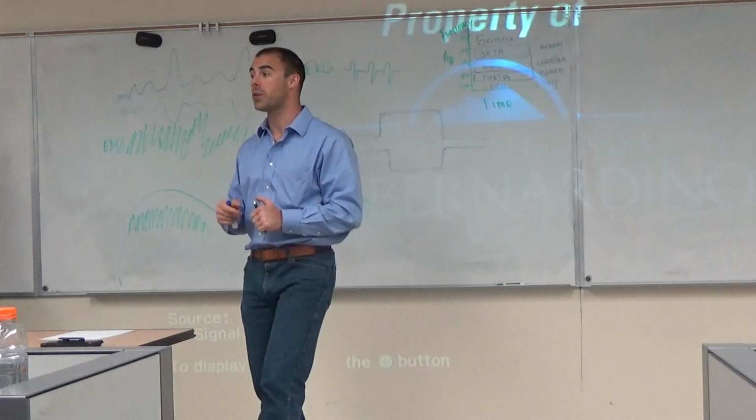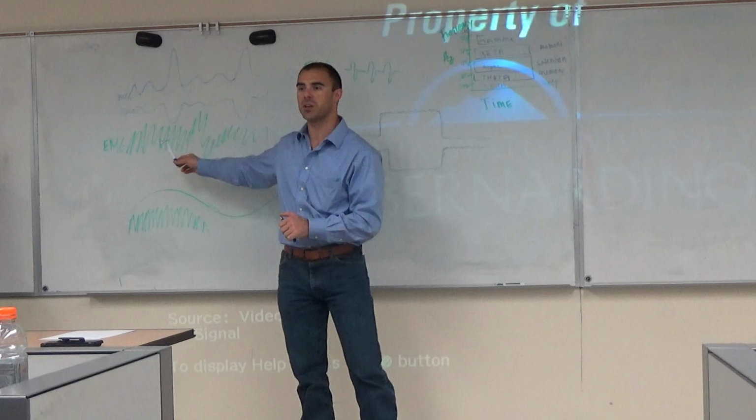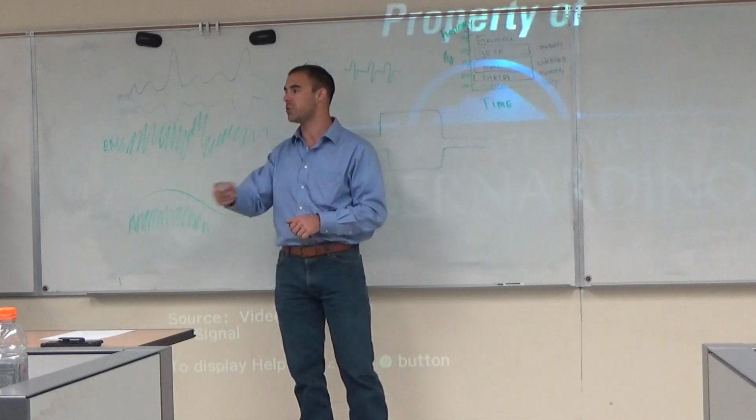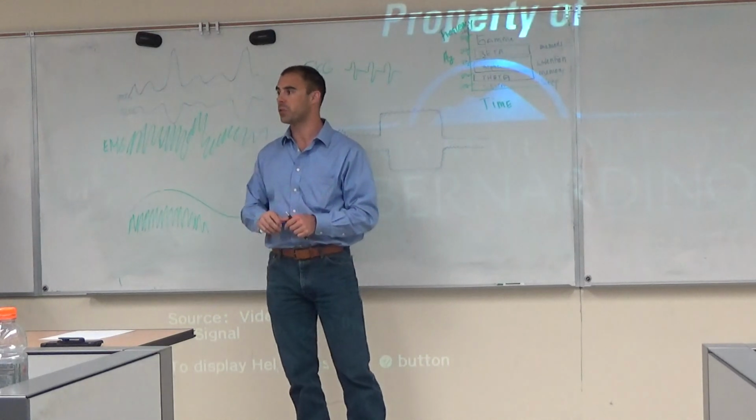One other thing we didn't get to last class, talking about ways to accommodate EMG, because there's going to be an element of noise in all of our EEG all the time, particularly muscle noise.